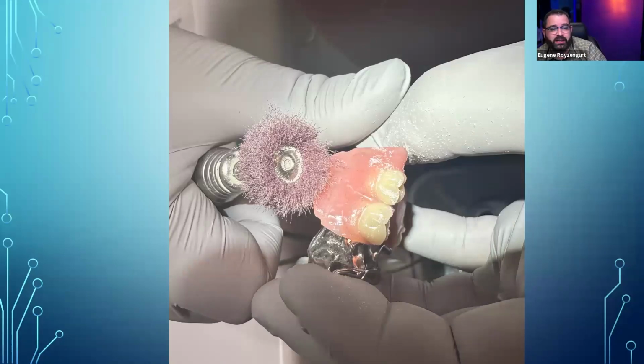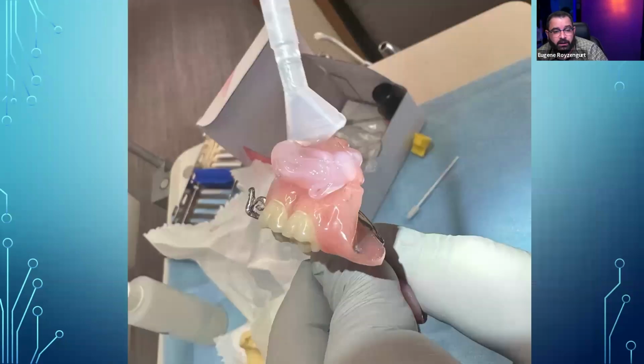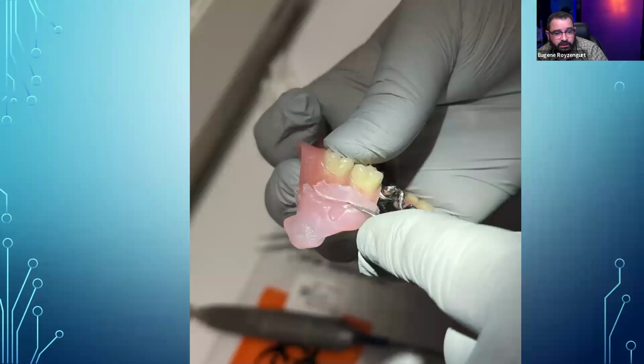Then make sure you use that little Scotch-Brite wheel to prep the surface, after which you want to make sure to apply the primer. Okay, don't forget the primer, because it's very important as well. Apply it over the entire surface where you want to bond the actual soft reline material. And once that dries, you can go ahead and apply the actual material to the top of the denture. And from there, we inserted it intraorally.